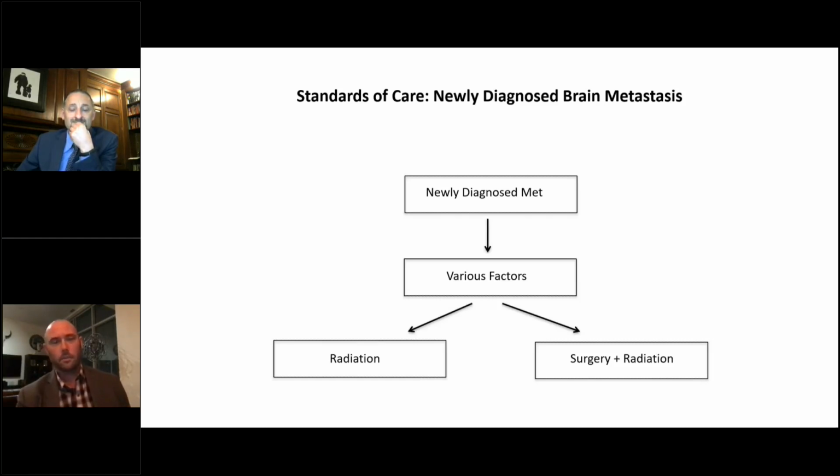But I think the simple fact is that, even if you're looking at, say, radiation necrosis, the laser treats that very, very well, because it's really not just necrosis. It's an inflammatory process that the laser, for reasons we don't fully understand, does a pretty good job of knocking out. And we'll get into that in a second as well. So yeah, give them one surgery.